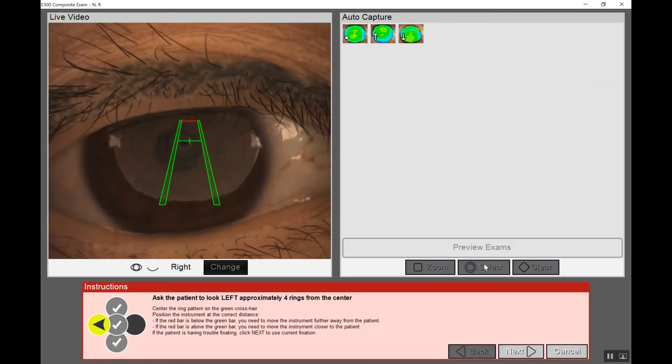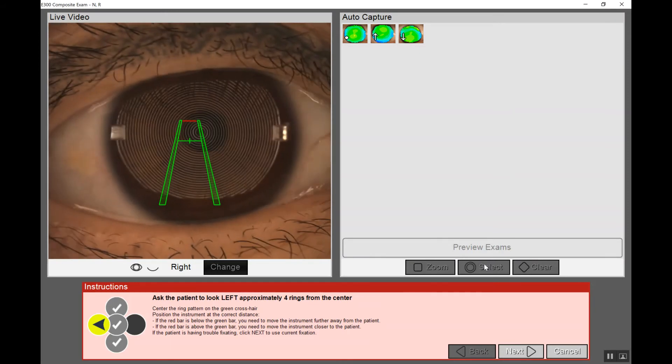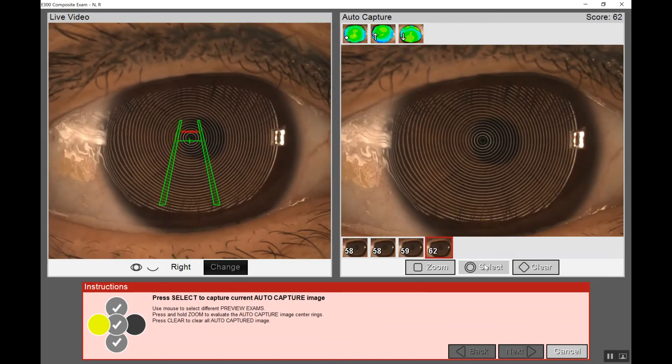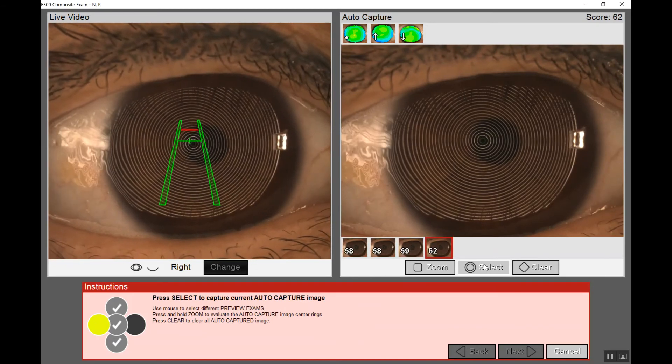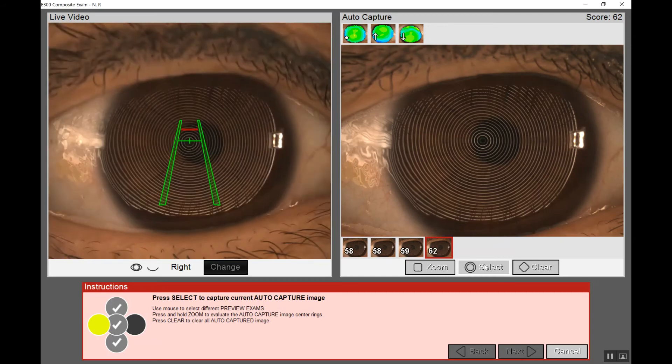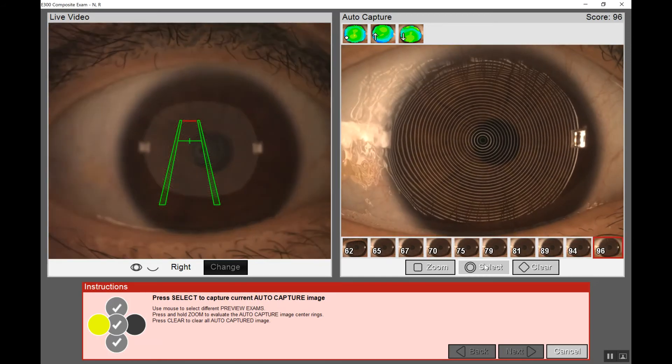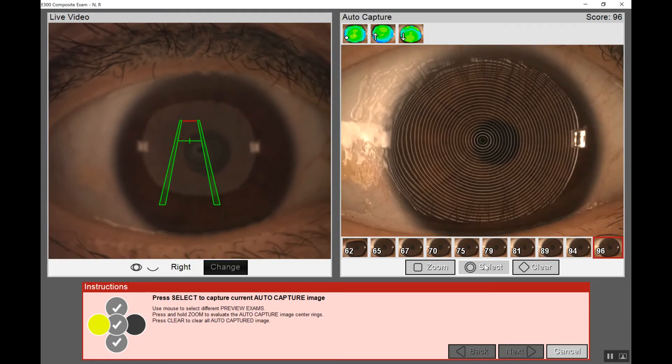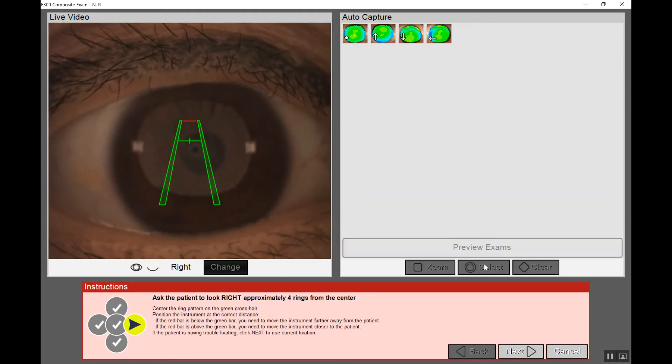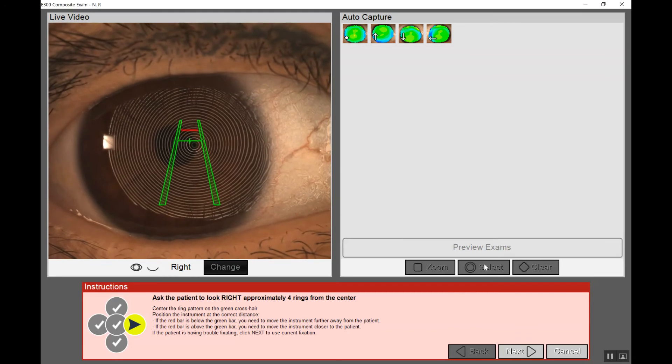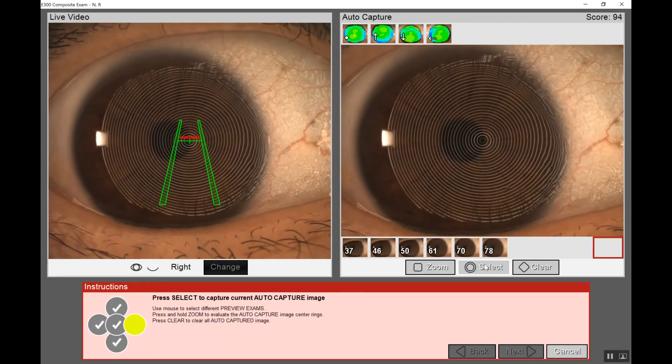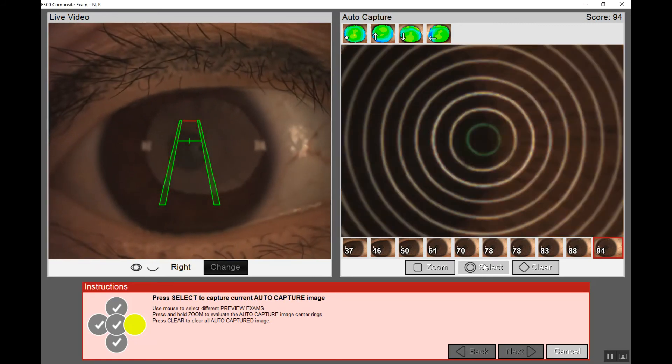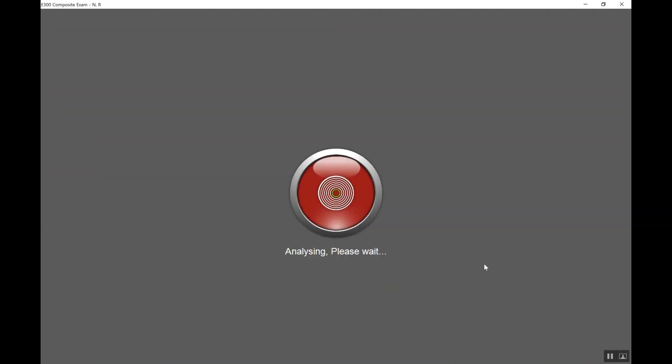The software is now asking us to have the patient look left four rings. Again we'll do a simple capture fixating the green crosshair on the central ring and aligning the red distance indicator. We'll ask our patient to open up wide and take a blink. Make sure the tear film is smooth and once we're happy with that capture again we'll zoom in and we see beautifully parallel and even rings. We'll click select and the software will ask for the final capture. Ask the patient to look right approximately four rings. We'll center the unit asking the patient to blink and open up wide. Now we have our 94% capture. Let's confirm that we have an acceptable ring reflection. That's looking really good. We can click select.